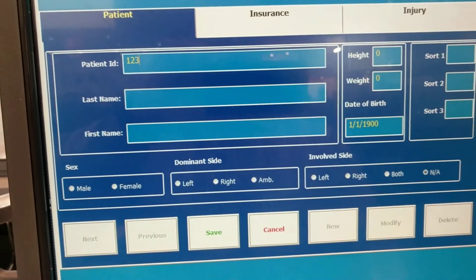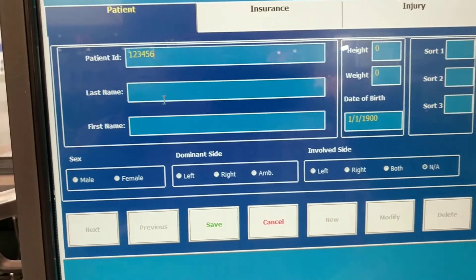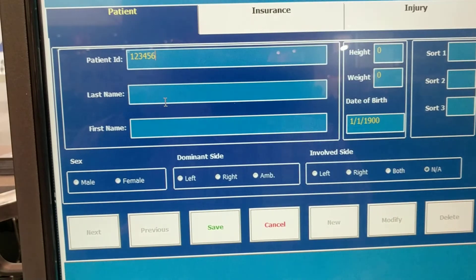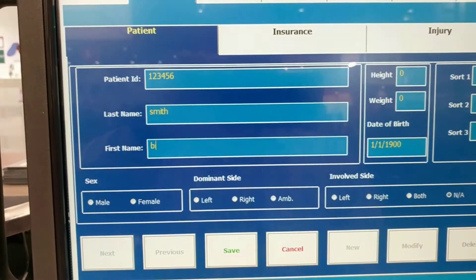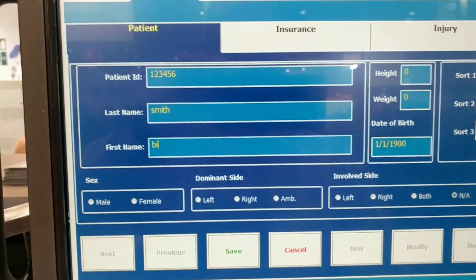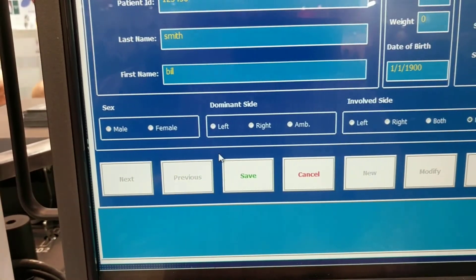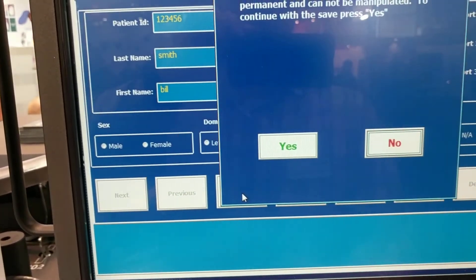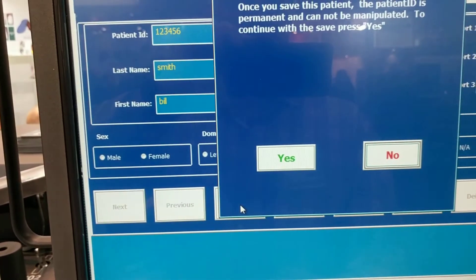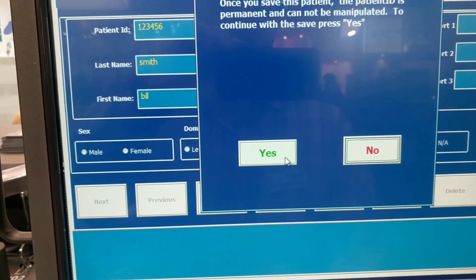You're required to enter three pieces of information: the patient ID and a first name. When you press Save, you will then be given a prompt that the patient ID cannot be manipulated.